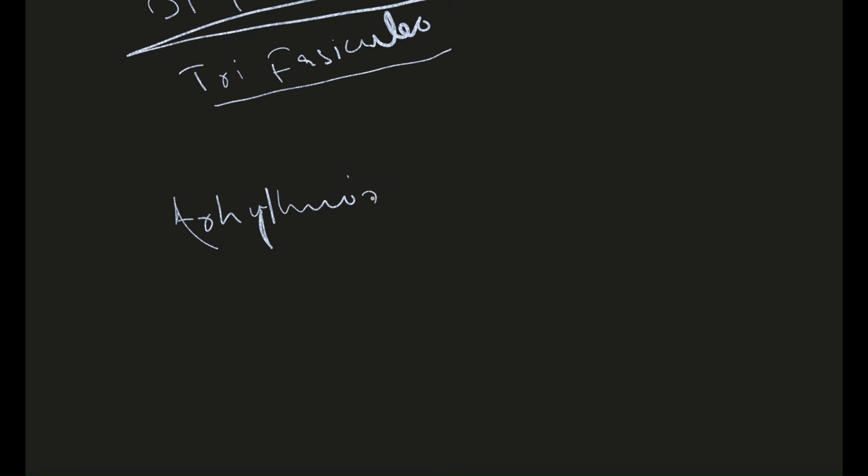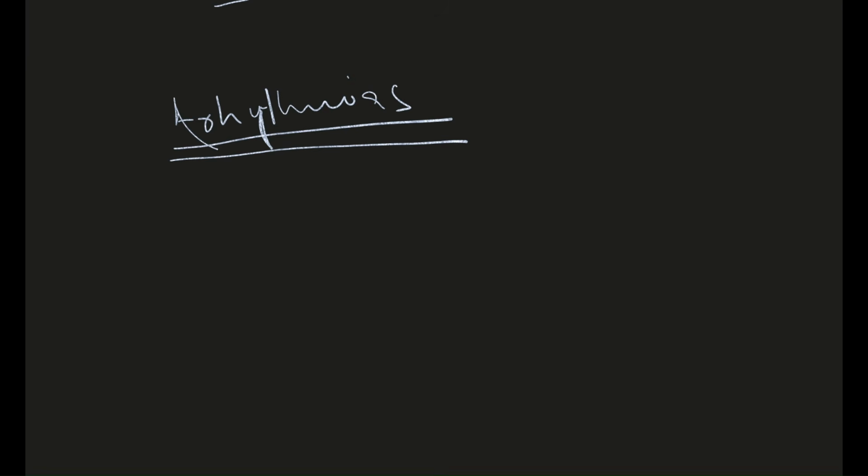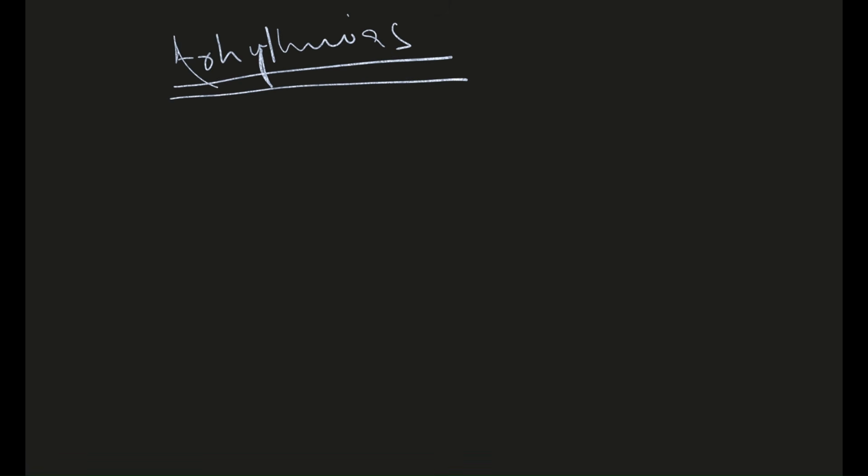arrhythmias. There are many classifications of arrhythmias, but I will not be going into the details of classification because of tachyarrhythmias, bradyarrhythmias, then narrow complex tachyarrhythmias, wide complex, and there is a huge mess in that, and you will definitely get puzzled by hearing about it. Let's just keep it simple. Very common presentation, I'm going to talk about atrial fibrillation.